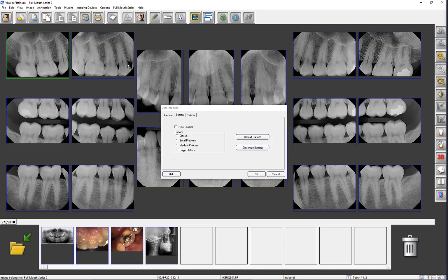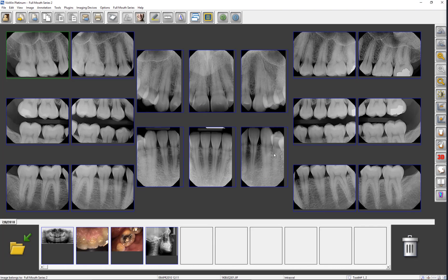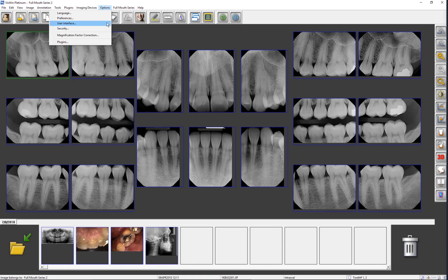Click Close to return to the User Interface dialog window. Let's click Default Buttons to revert to the default view, restoring any deleted buttons and removing any buttons added. Notice the Rotate 180 degrees is no longer on the toolbar. If you have any unanswered questions, you may click on Help which will open the VixWin Platinum User Manual. The Sidebar tab allows you to make the same type of changes for the sidebar as we have just done for the toolbar.